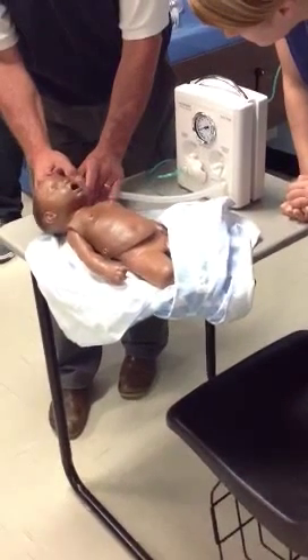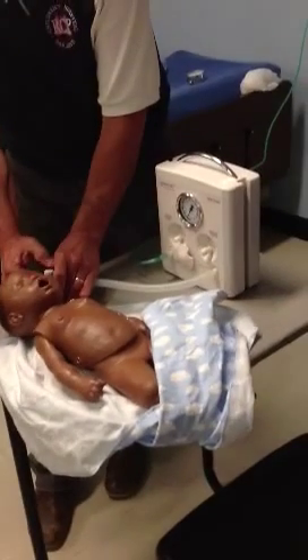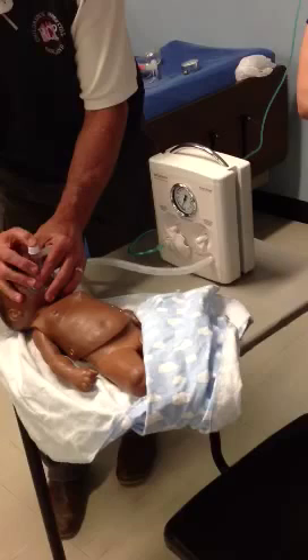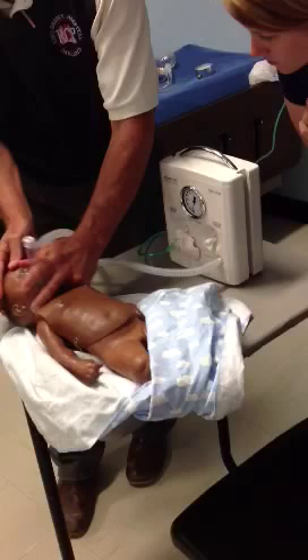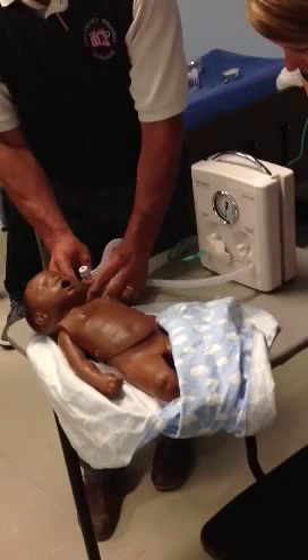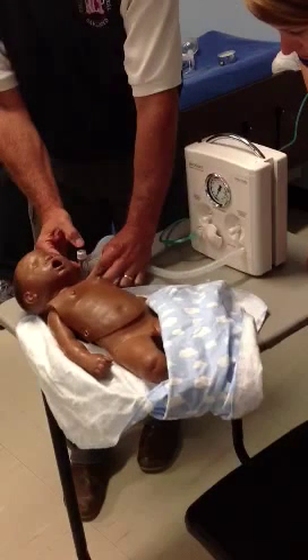Peak inspiratory pressure — not your PEEP. So this is PIP and PEEP. I want 20 over 5. If I could get a good seal, I'd do it on the baby. I want to do 20 over 5, which is what I recommend as a start-up.